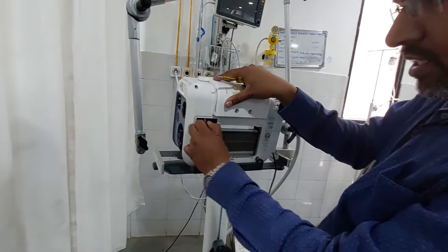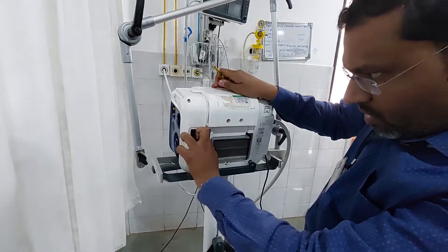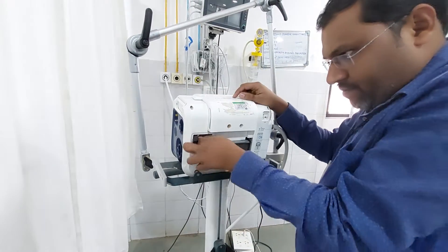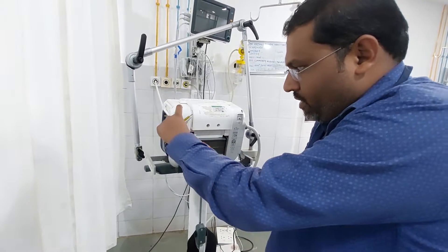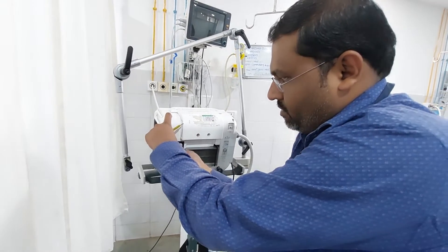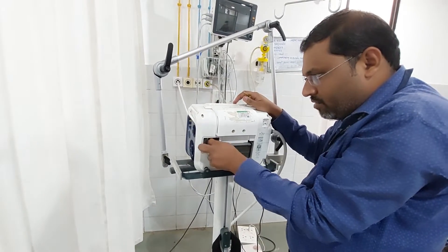You just disconnect the cable and rotate it. Don't pull it out. You have to take care — just first rotate it. Rotate it properly, then only it will come out. Don't pull it. If you try to pull it, it will be damaged.